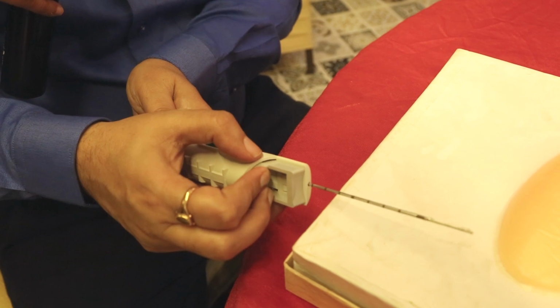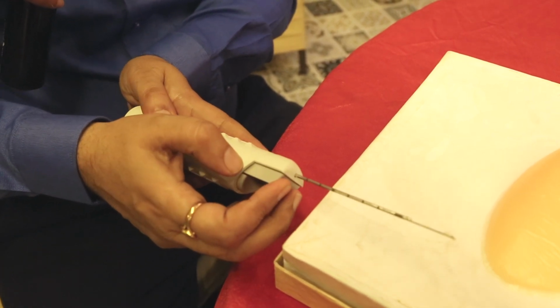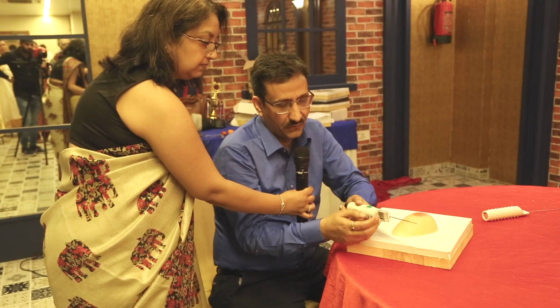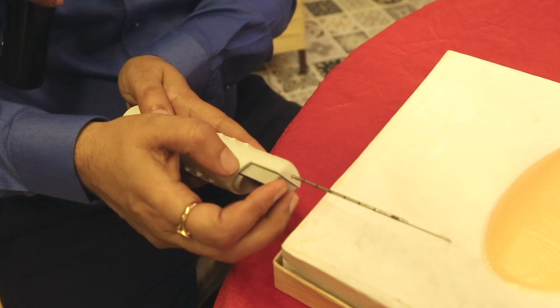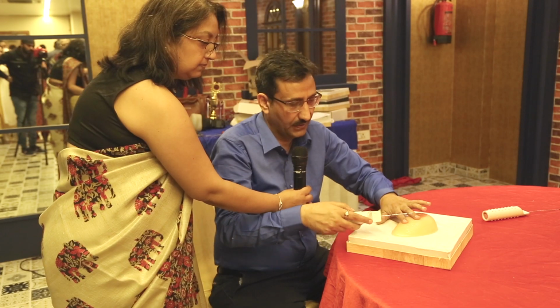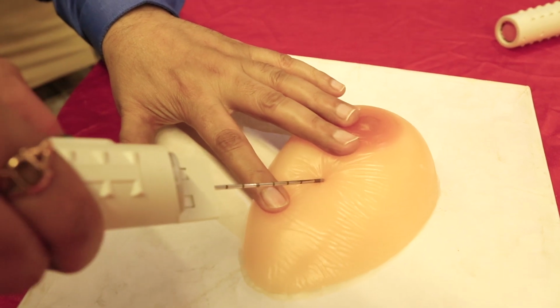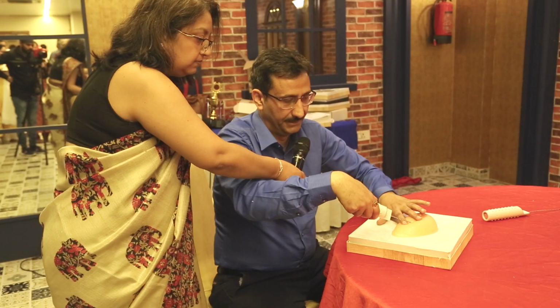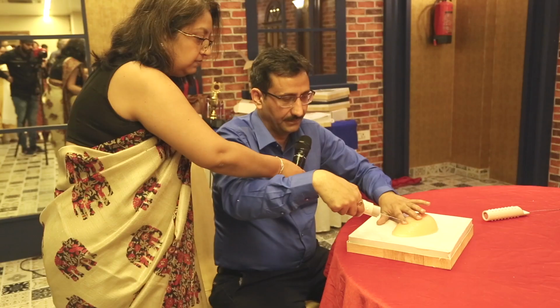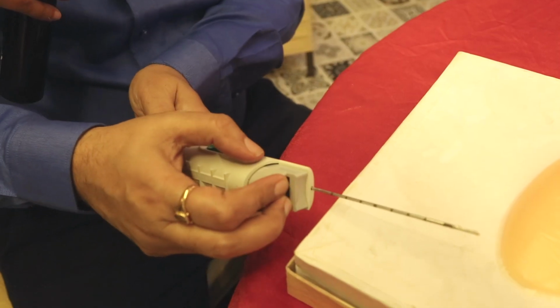First, this is a sampling chamber, and this is the cutting sheath. First we will do this, then we will do this, then we will localize it and go through this. Fire from this. There is a button here. Okay. We will do it like this.